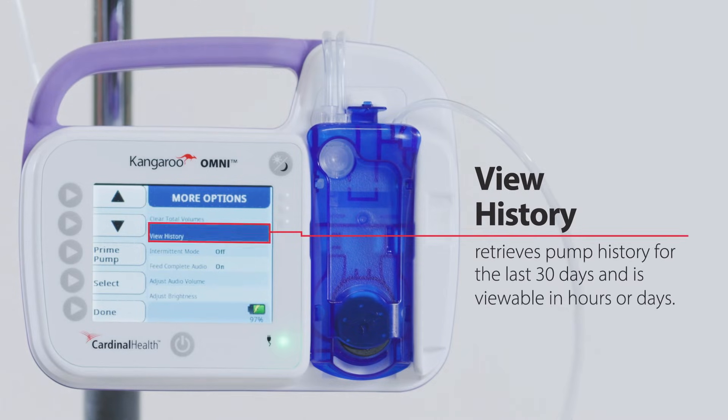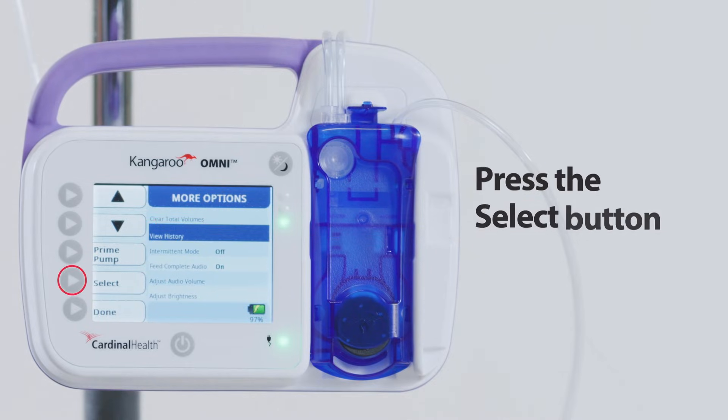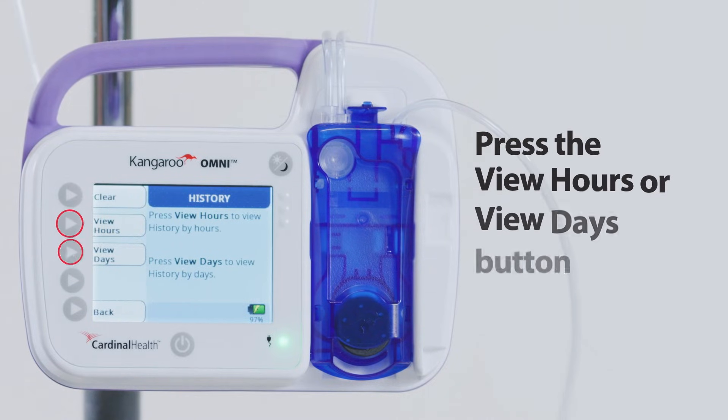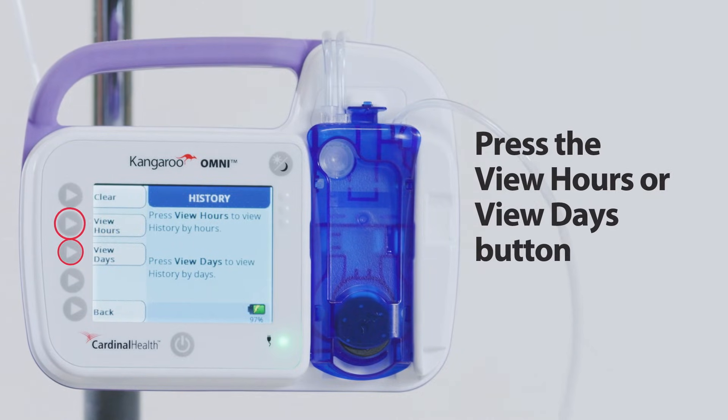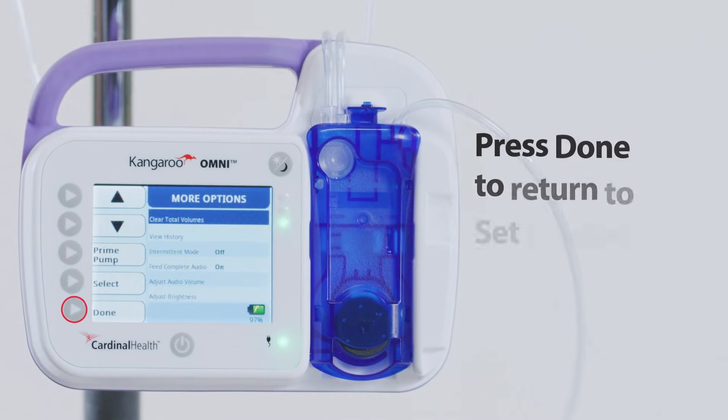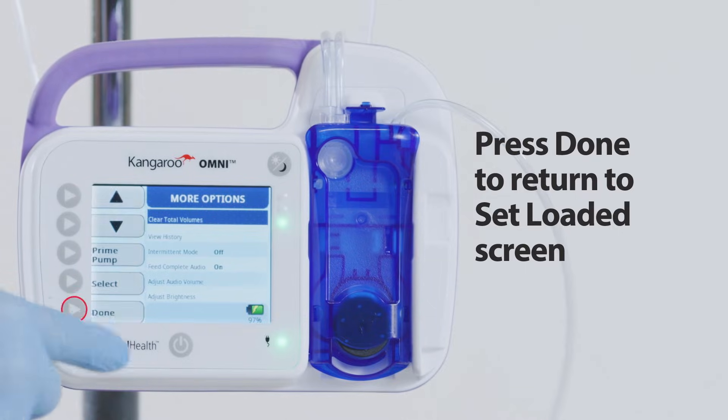View history retrieves pump history for the last 30 days and is viewable in hours or days. Press the Select button to activate the highlighted feature. You can press the View Hours or View Days button to retrieve the information. Press Back to return to More Options, then press Done to return to the Set Loaded screen.